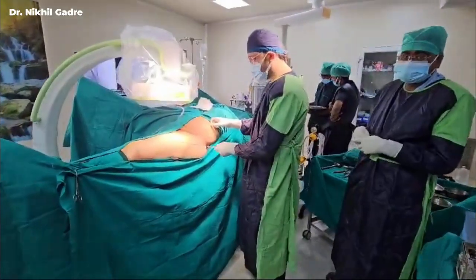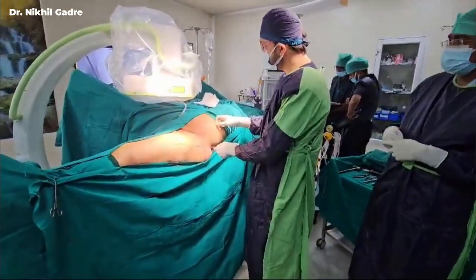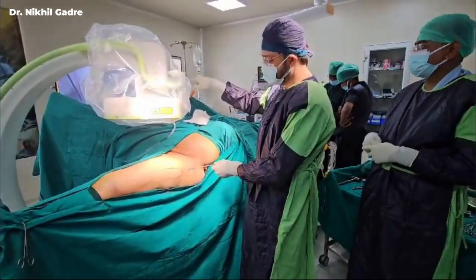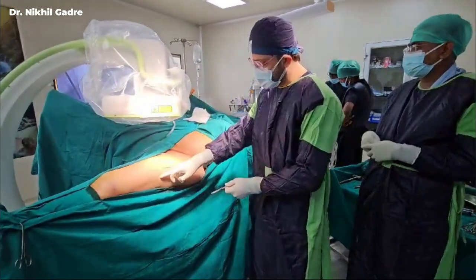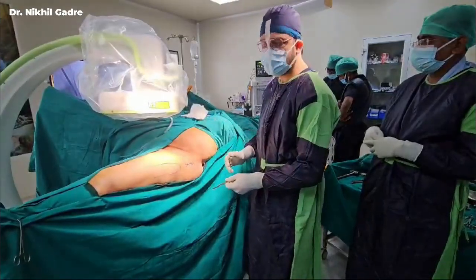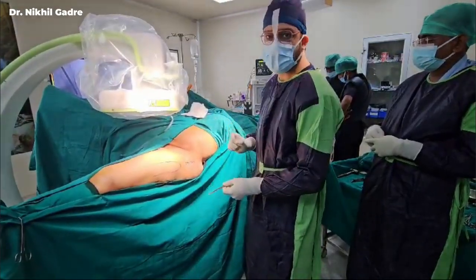Incision need not be long. It is hardly a 4 to 5 centimeter incision. But as you see in the C-arm, we make it a point to mark it on the C-arm and check it. It should be in line with the femoral canal, so you don't have to struggle to go anteriorly or posteriorly and can get pitch perfect entry.